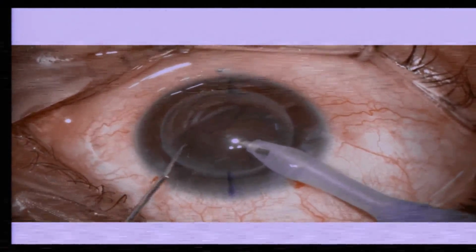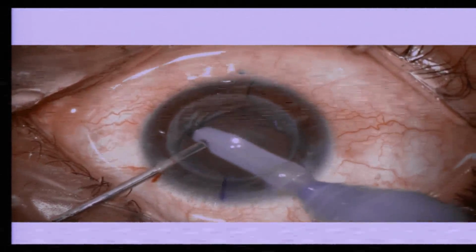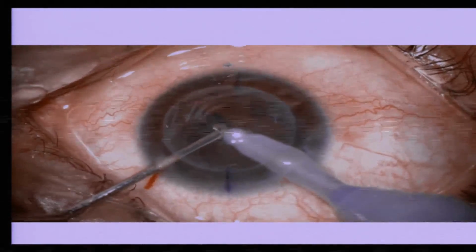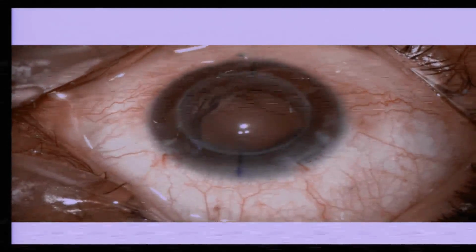But if you do have a conventional moderate to hard cataract, you do just like what you would do in a patient with compromised endothelium. You will use all the lower parameters in terms of your flow, your aspiration and the phaco energy, and you would take time to break the cataract into small pieces and then remove it from the eye.